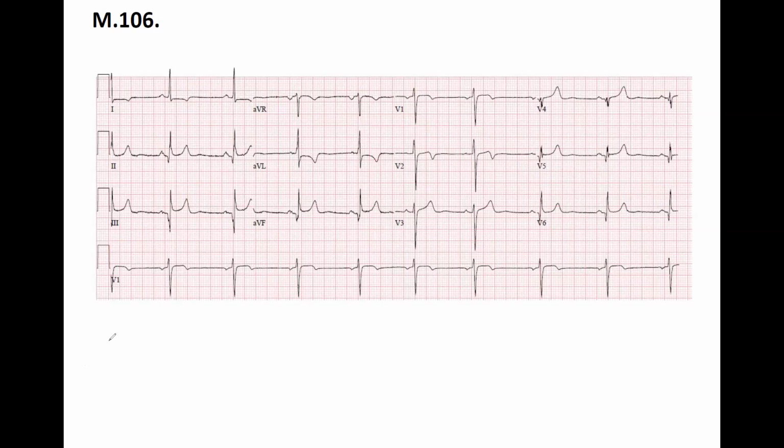First, when we have an MI and you close the coronary, very quickly the ischemia is reaching a lesion. That's the sign of the lesion, the ST elevation, okay? This is what we call hyperacute. So it's an ongoing situation that is relatively right away. It's a couple of minutes, that's the time when we have this ST elevation.